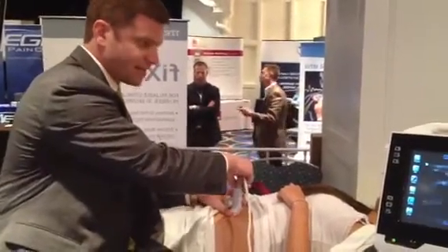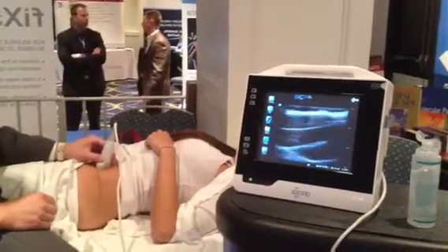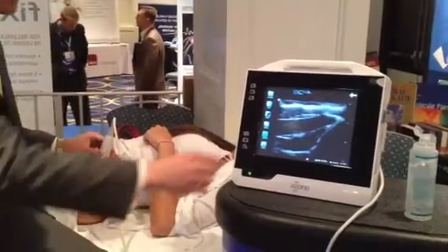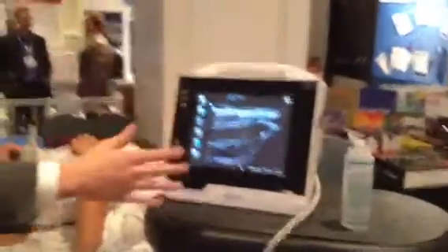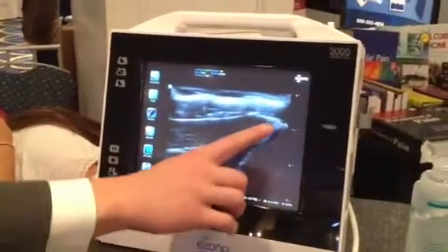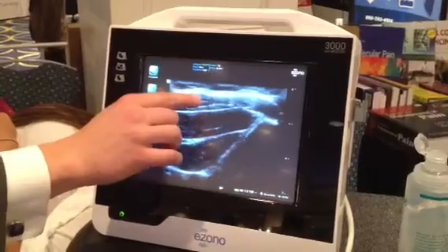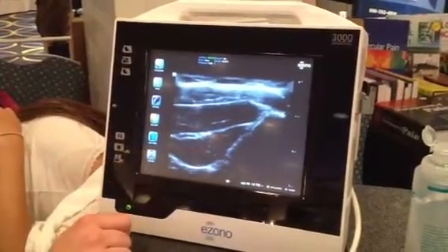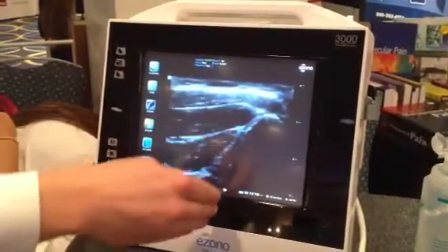If I drop my probe on this, what I'm going to see is a beautiful image of the three muscle bellies that I want to visualize. You can see them here. The three structures we're seeing here are three muscle bellies: this is the external oblique, the internal oblique, and the transverse abdominus. This is the ASIS — you can see the bone, with all that shadowing right here.